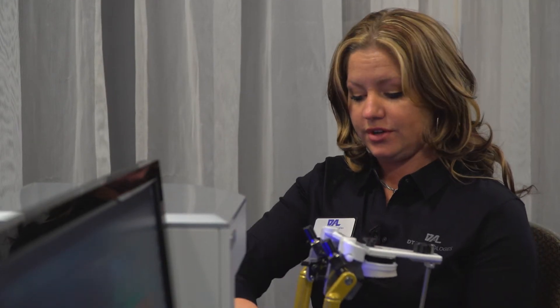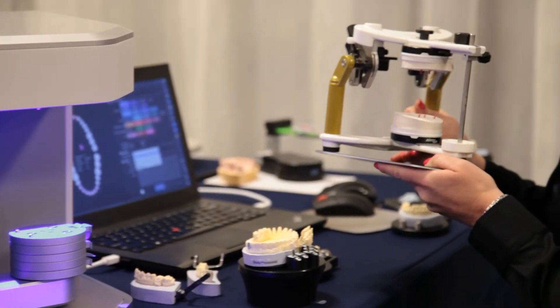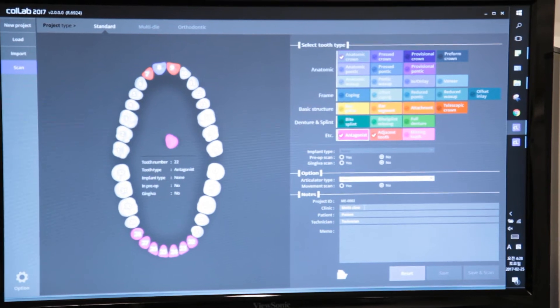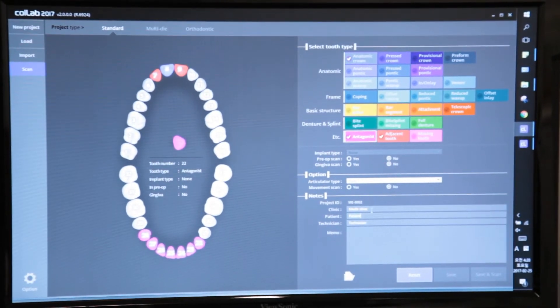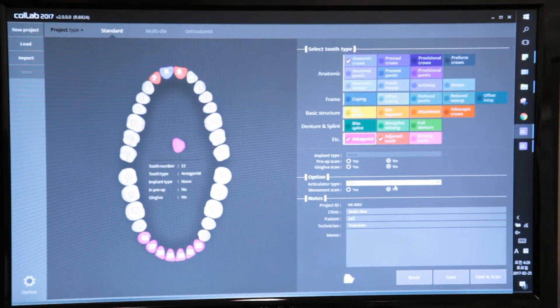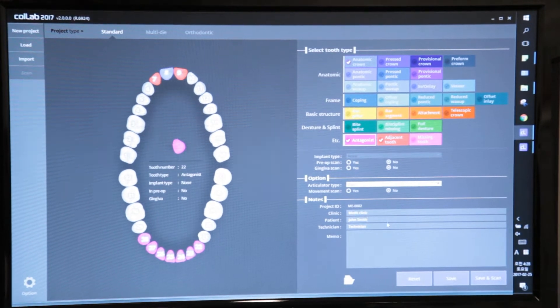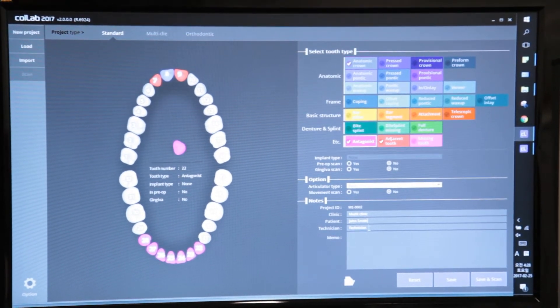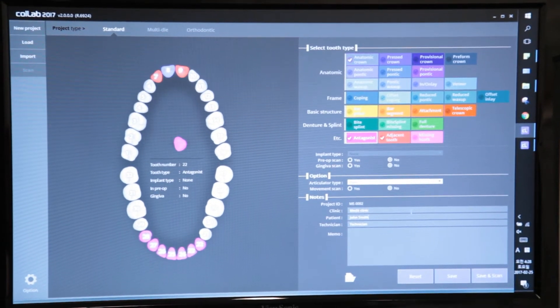Anything that fits inside this scanner — I have not found an articulator yet that can't fit in here. Next, we're going to select our patient name, and you can certainly put your own clinic in as well. We'll start with a typical John Smith, and you can put in your technician name as well if you'd like to keep track of the technicians scanning for you.